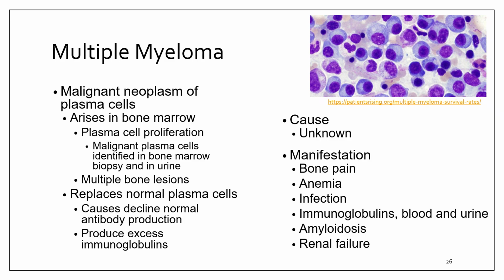When you look at bone marrow biopsies or aspirates, you may see sheets of plasma cells, eccentric nuclei, clock-faced chromatin, and prominent nuclear hof, which is the Golgi zone. Sometimes you'll also see Russell bodies, which are intracellular immunoglobulin, Mott cells, which are plasma cells stuffed with antibody, and basically plasma cells that ordered too much from Amazon and can't return it.